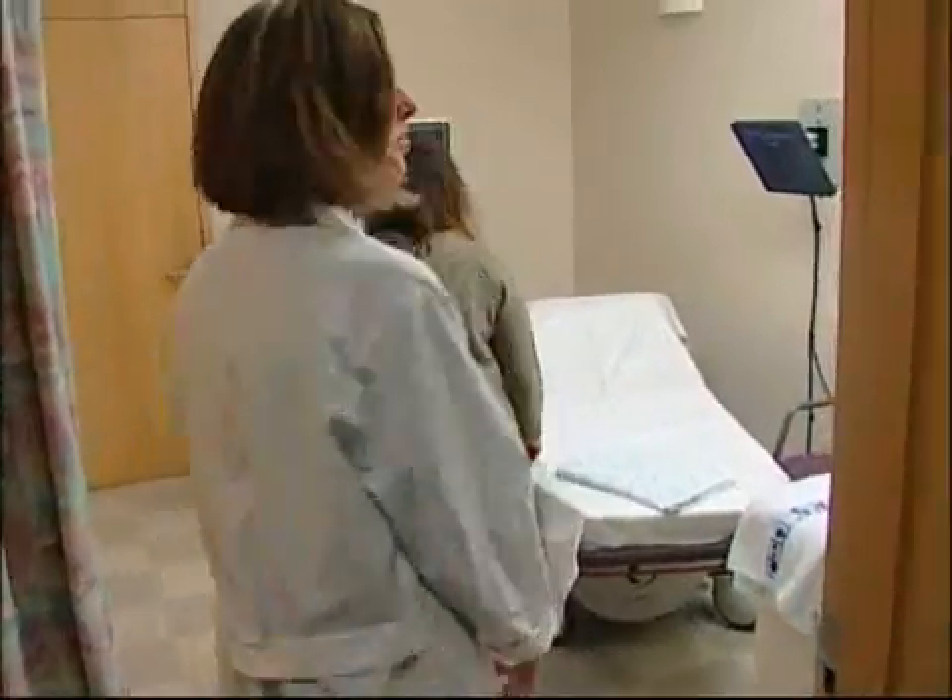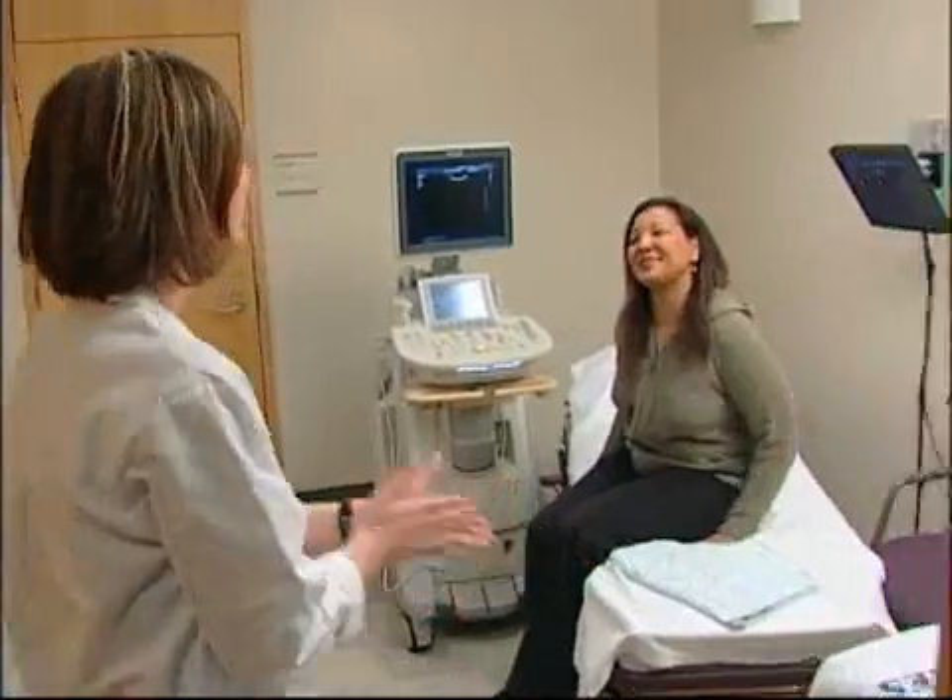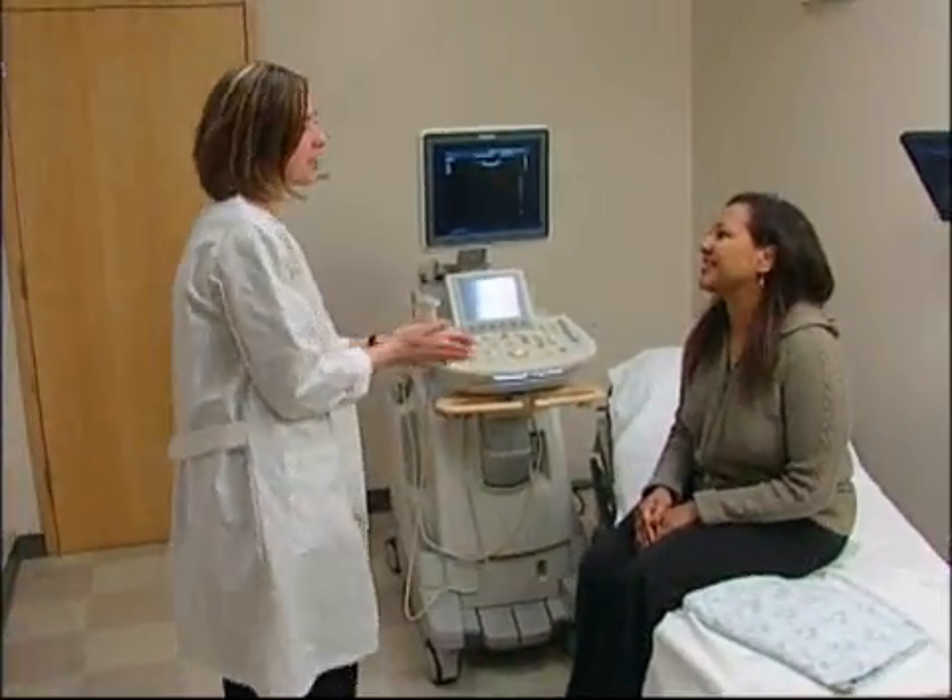Some ultrasounds require the patient not to eat or drink before the procedure. Others require a full bladder. Consult with your doctor about your ultrasound preparation.